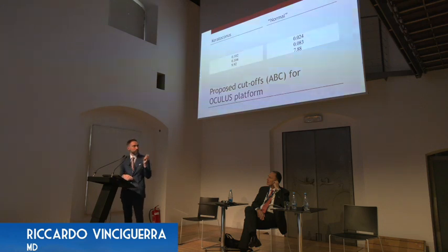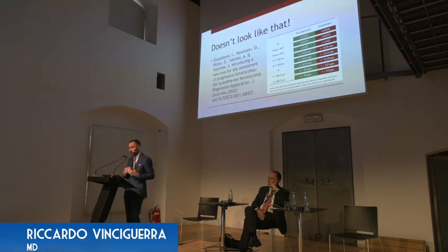But regardless of that, you can see that the noise level is incredibly different, and this is A, B, and C. So this is the noise level, the confidence interval for A, B, and C values in the platform. You can see that between normal and keratoconus, the A value is 4 times more. We are speaking about 4 times. It's incredibly more.